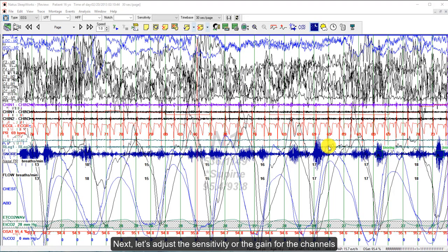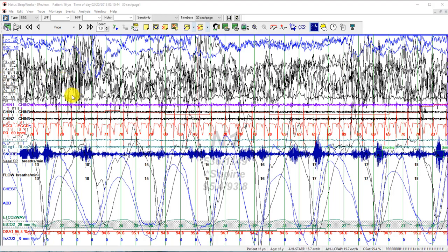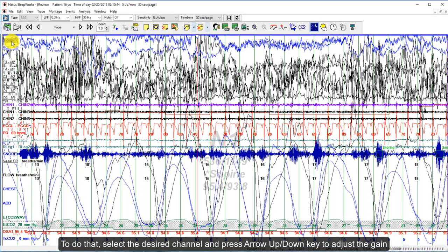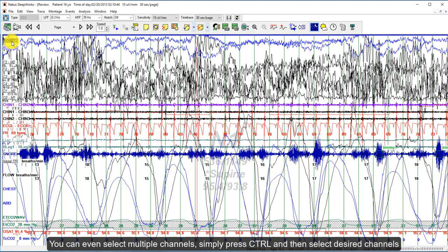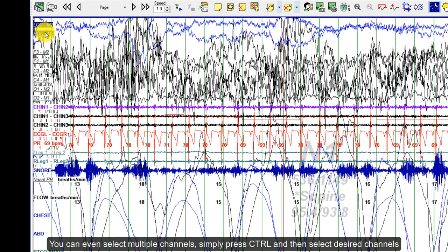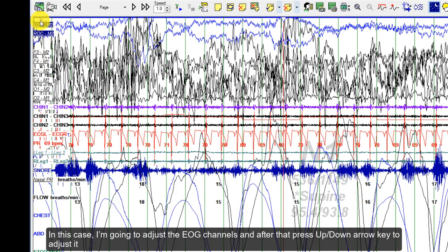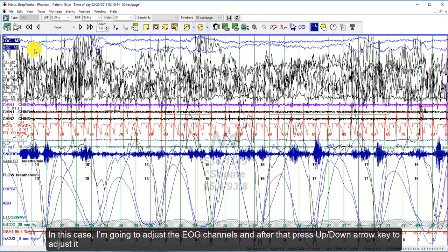Next, let's adjust the sensitivity or gain for the channels. Simply select the channel and then press the arrow up or down key to adjust the gain. You can even select multiple channels by pressing Ctrl and selecting the desired channels. In this case, I'm going to adjust the EOG channels, and then press up or down arrow key to adjust.